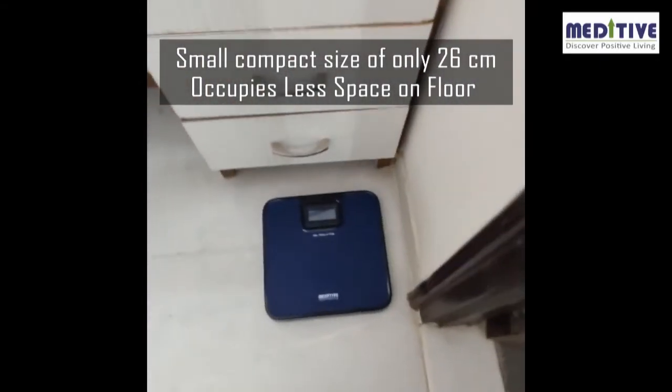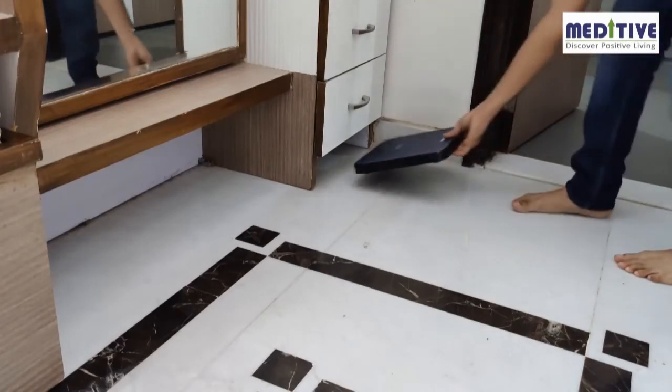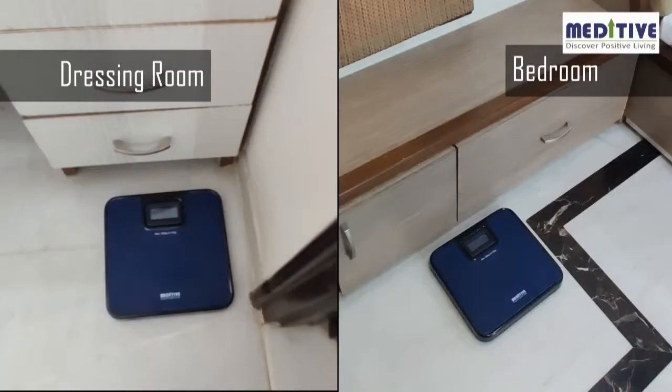This scale has been purposefully designed in a compact, small size so that it occupies less space on the floor. The size of the scale is only 26 centimeters, so you can continue to keep it on the floor with no need to store it away.